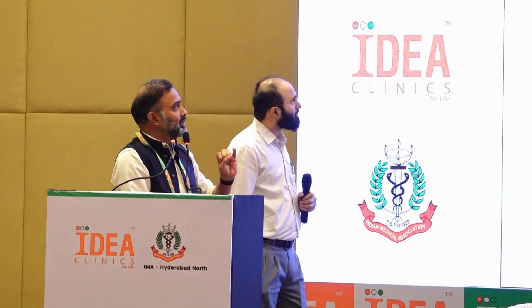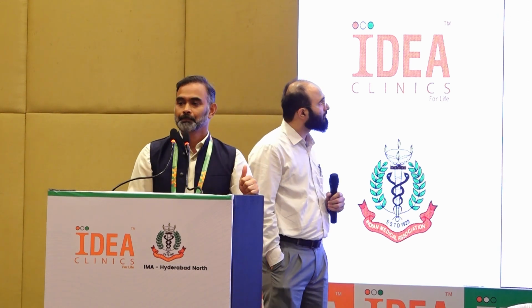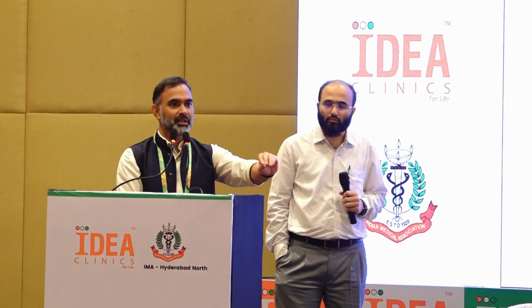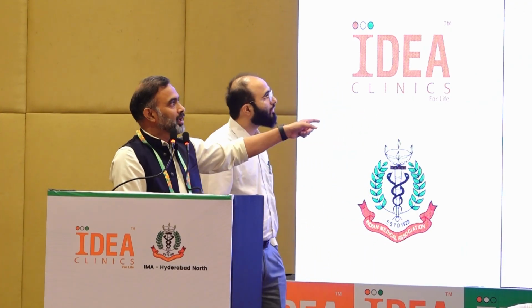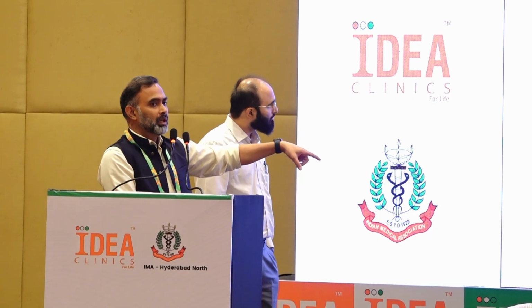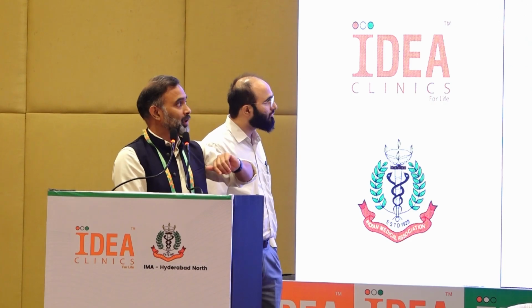So the 3 things about sensors is, one is auto-basal. That means we cannot set a basal for a child or an adult, whatever basal it is, 10, 12 units, it's not enough. One day it may be high, another day low, we have that fluctuation. So to mimic that artificial pancreas, with auto-basal, if the sugar is going down, it reduces the insulin delivery rate. If the sugar is going up, it increases your insulin delivery rate.